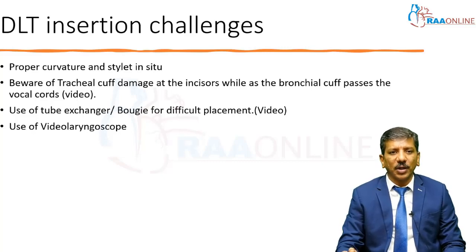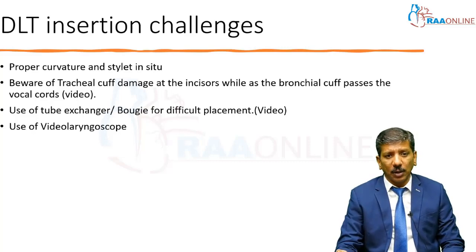And how will you use tube exchange if it is difficult to pass the DLT? And whether the video laryngoscope has totally replaced the conventional laryngoscope for DLT placement, let us see.